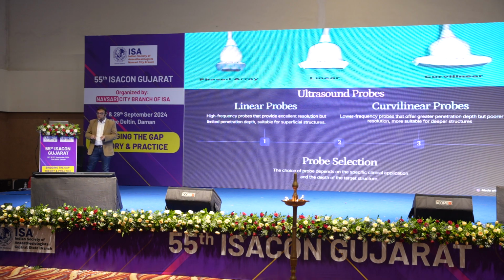And with a low frequency probe, your depth is going to be more, but your resolution is not as good as a linear, a high frequency probe. So we will remember, linear probe is a high frequency probe, whereas the curvilinear probe is the low frequency probe. So if your desired structure where you are going to block or cannulate is deep, then you are going to use curvilinear. If it is superficial, you are going to use a linear probe.